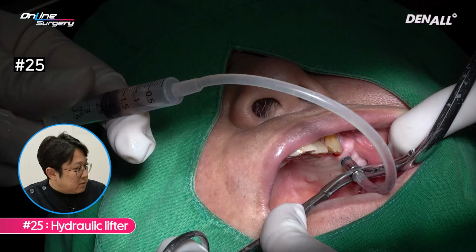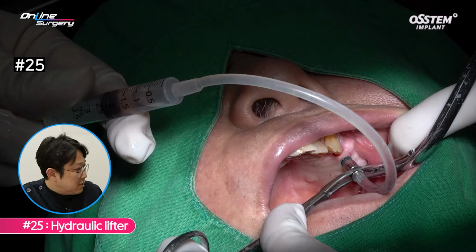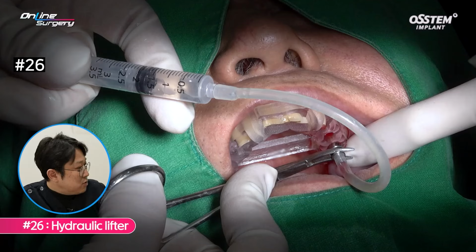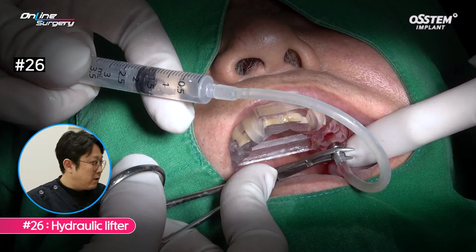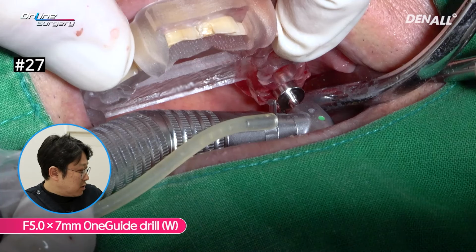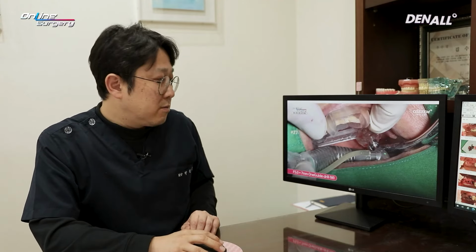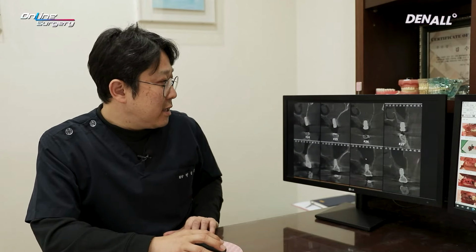Gradual drilling was done, and when I did aspiration, I assumed that the membrane was not penetrated and placed the implant. Bleeding was observed, hence I thought sinus membrane lift was done properly and placed the implant. In number 26, I checked whether there was a membrane penetration, and I thought that membrane lift was done nicely. In number 27, when I did drilling up to number 26, the membrane was lifted properly. In number 27, there was sufficient residual bone, so I wasn't really stressed here. Following the plan, drilling was done and implant was placed.